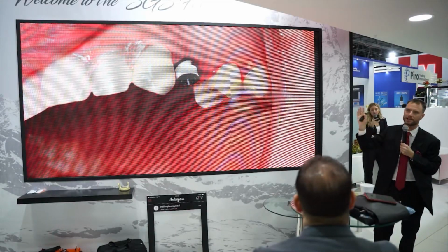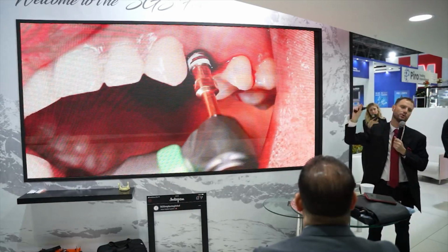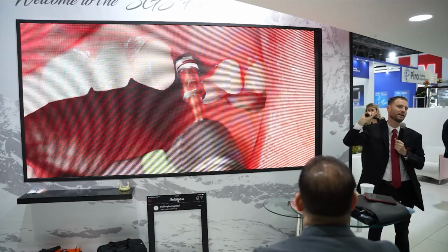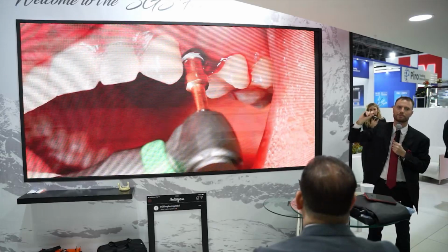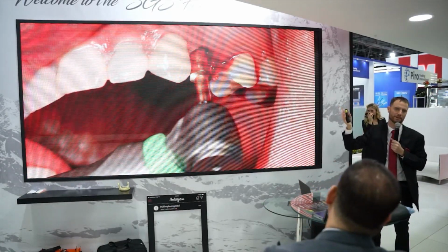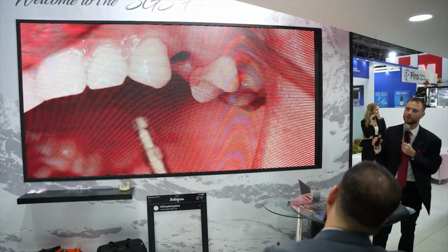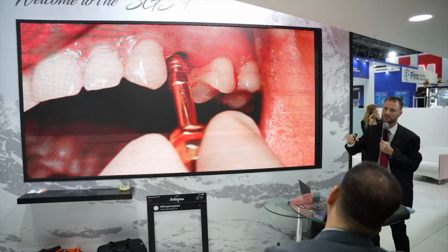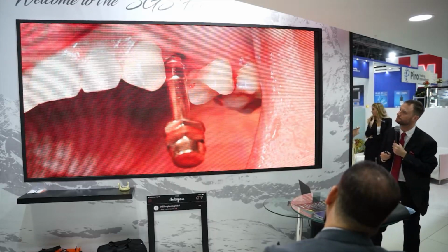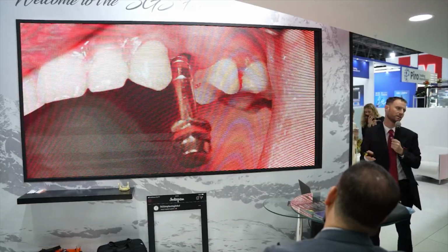I tell you every year, who's here earlier, that we need to remove the carrier before putting high torque on the implant. So when you start implantation, you go till a wide, then you remove the carrier and go directly into the implant with the instruments. That's where you achieve high torque. So that's how you can go for 60, 70 Newton centimeters as much as you like. I prefer to finish with a hand ratchet, not with a machine.